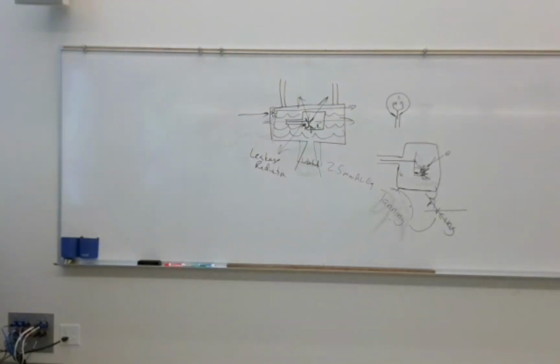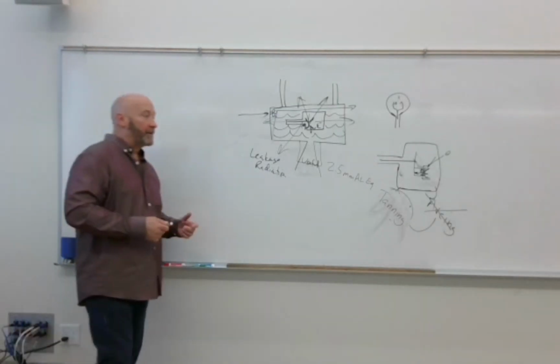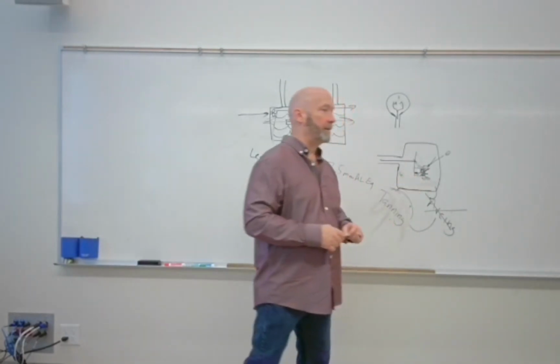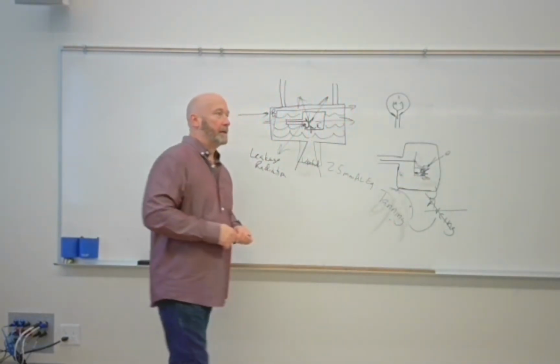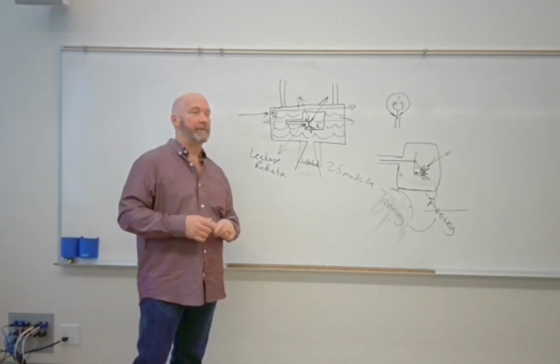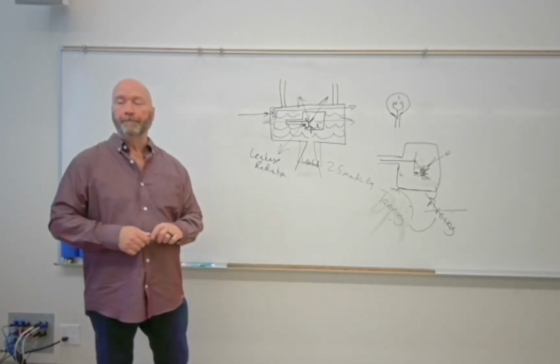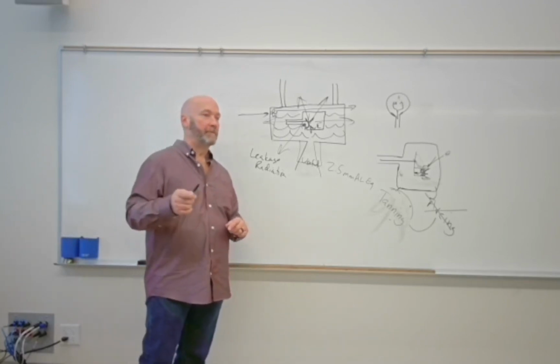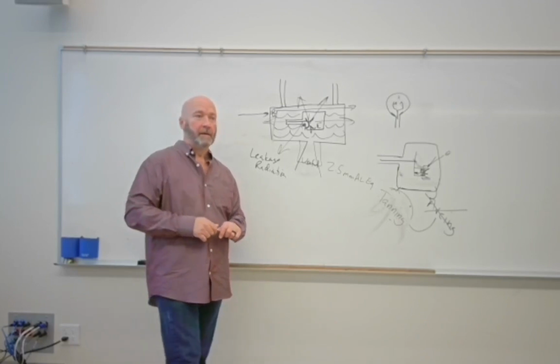So what's it made of? Well, it's made of tungsten primarily, for a couple of different reasons. One is it's good for thermionic emission. Both the filament and the target are made of tungsten. But one of the other reasons is that tungsten is, I won't say completely unique, but unique enough that it doesn't behave like some other things.